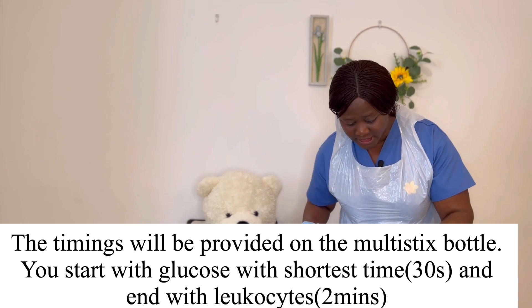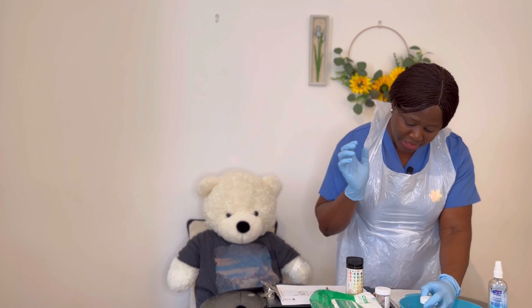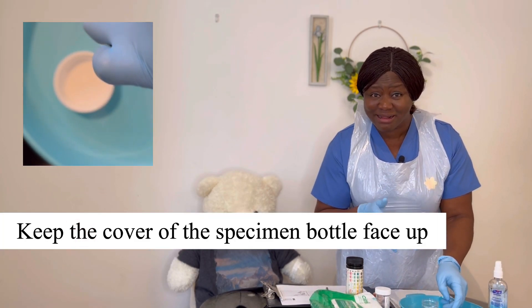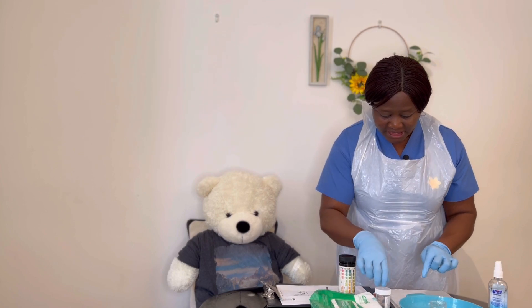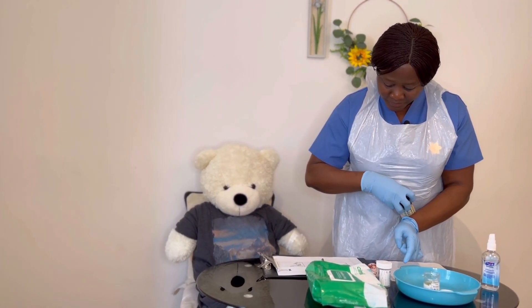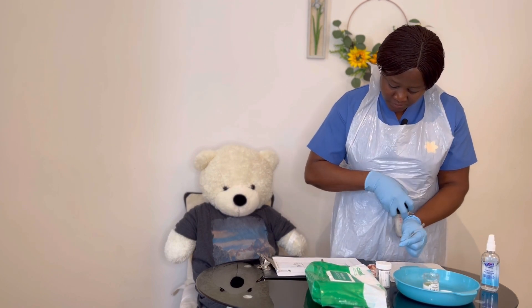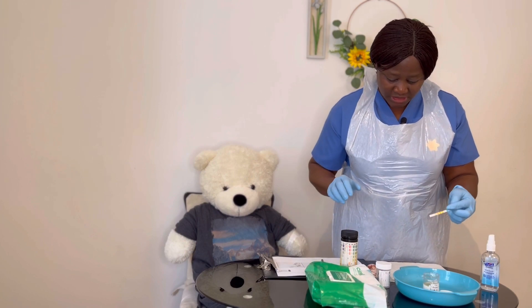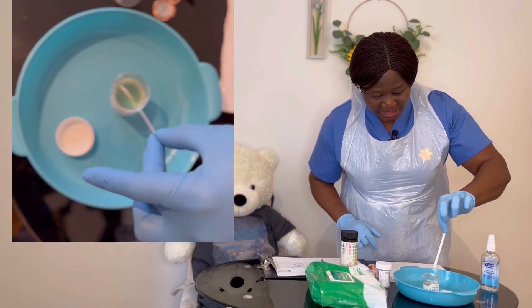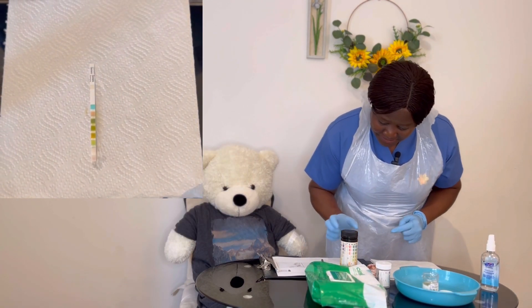This is my dirty hand; this is my clean hand. This is the urine sample — the outer part is okay, I've not contaminated it. I'll open it. If you want to talk about the characteristics of urine, it's not compulsory and not part of the marking criteria, but you can comment on the color, odor, and any deposit. I'm waiting for the second hand to reach 12. I take one reagent strip, cover the bottle immediately to not expose it. It's on 12 — I dip the strip for 1 second, making sure all the pads are covered, tap it at an angle, and place it straight in front of me. My time starts now, assessor.